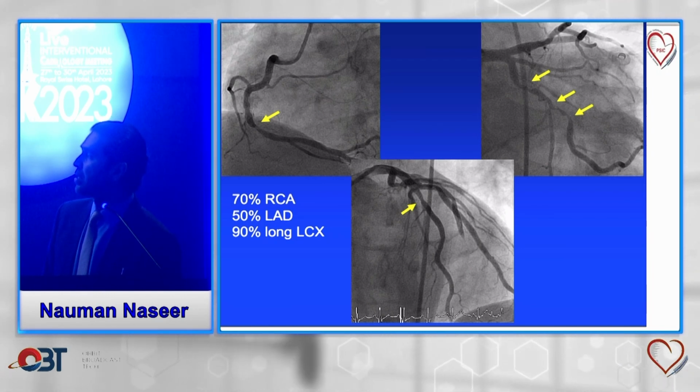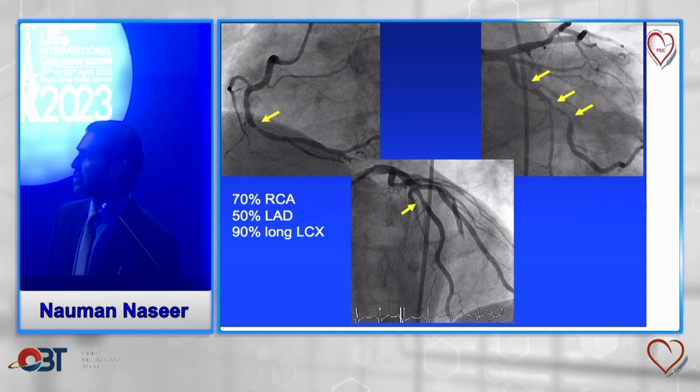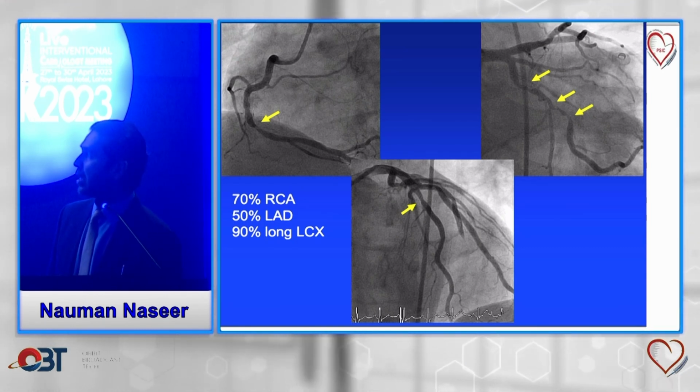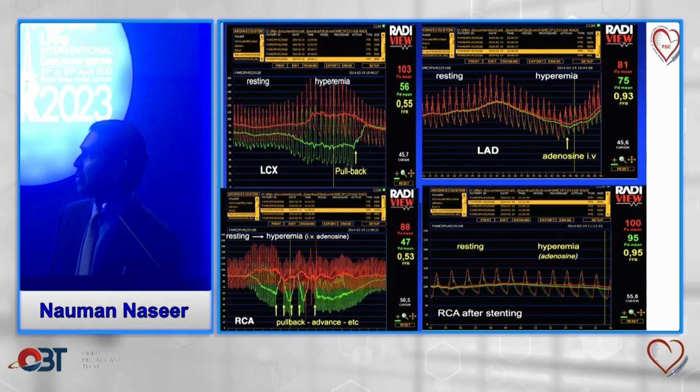Now in multivessel coronary artery disease also, this is clearly tight, you know that. But what about the other lesions? Should we fix them or not? It's very helpful that you do pressure wire guided PCIs. The literature has also shown better outcomes with that.